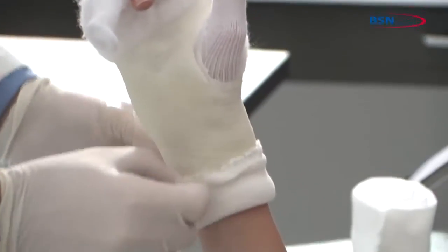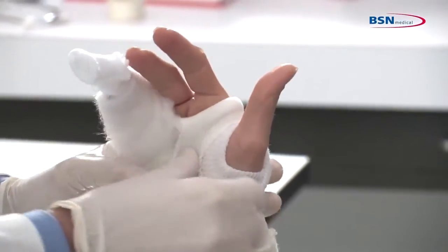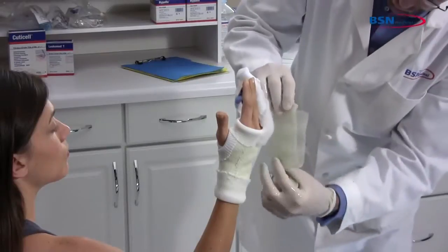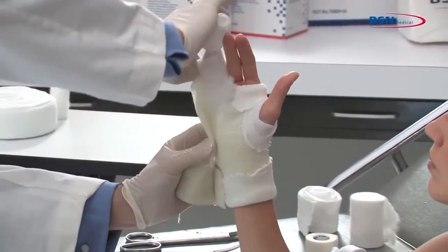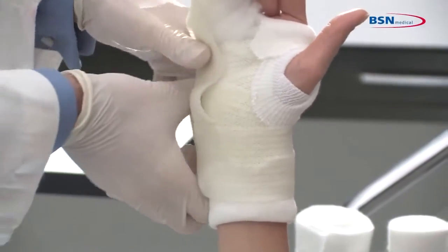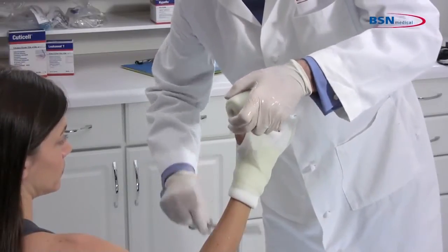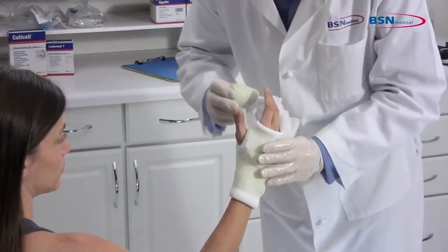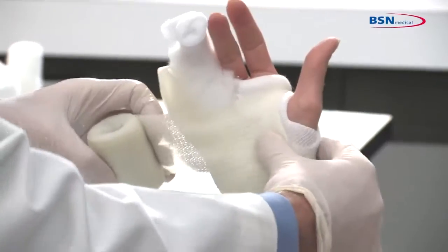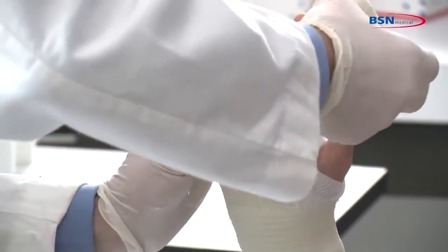Fold back the stockinette for protection of the skin and a soft edge. Dip the reinforcement strip in water and apply to the lateral aspect of the hand and fifth phalange. Secure the reinforcement strip with the cast tape starting at the wrist. Make a cut at the thumb to easily pass through the webspace. Curl the cut edges under to create a smoother edge. Pass twice around the fourth and fifth phalanges and continue toward the wrist.